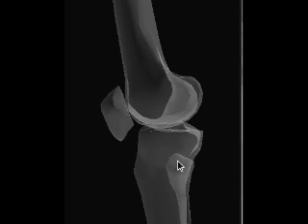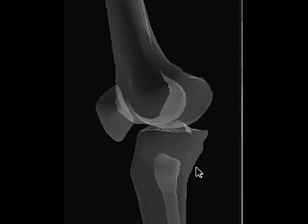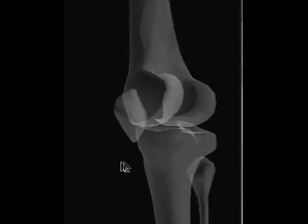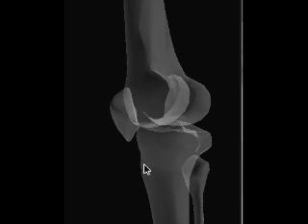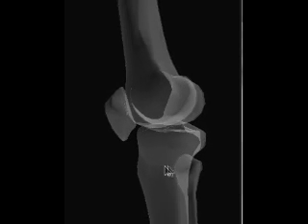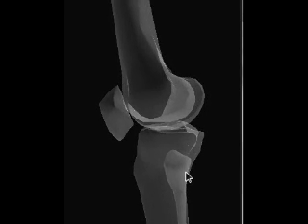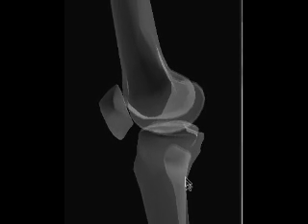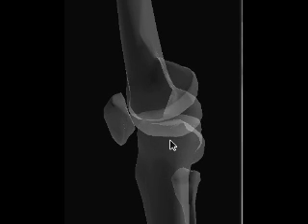So, very simply: if the fibula is completely superimposed over the tibia, you know that you are not rotated enough externally. A complete lack of superimposition would mean that you have rotated too much. And also, if the fibular head appears closer to the condyles than what you're used to seeing, it means that you don't have enough cephalad angulation. A larger gap between the fibular head and the condyles means that you have angled too steeply.